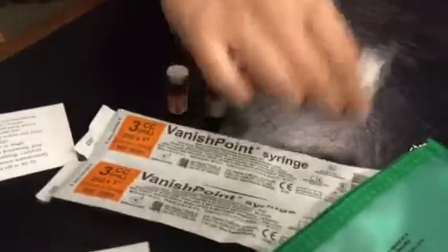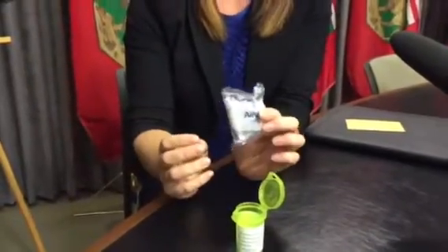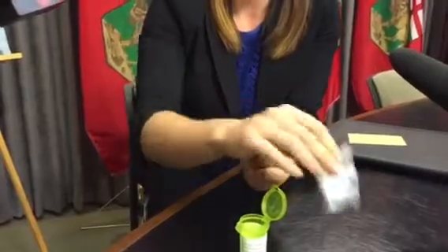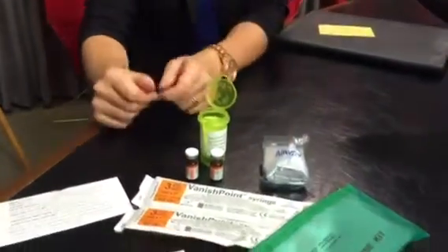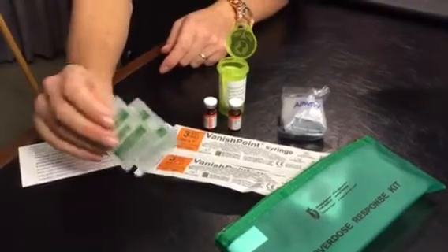Within the kit, to assist with rescue breaths, there is a breathing mask which makes rescue breaths a bit easier and also protects the person who's giving the breaths. There are also some antiseptic wipes to help prevent infection from the injection itself.